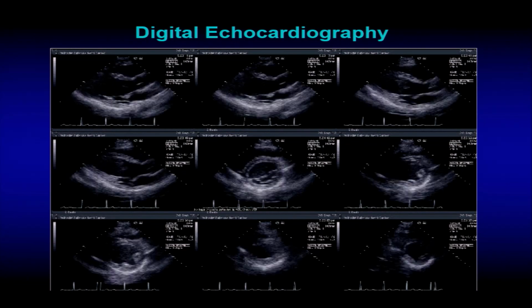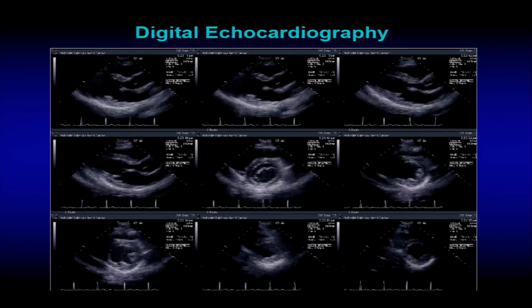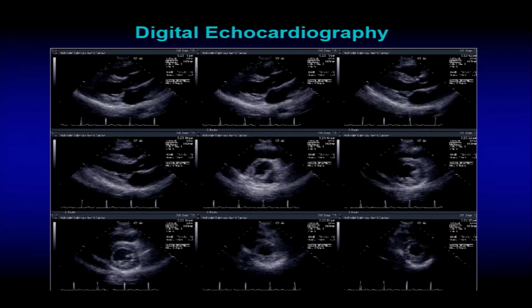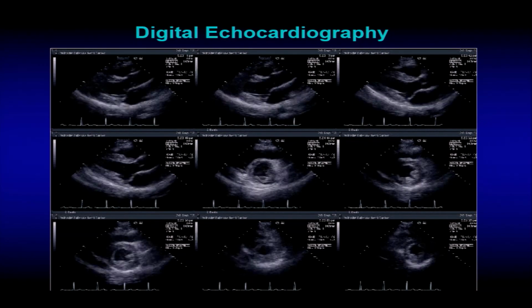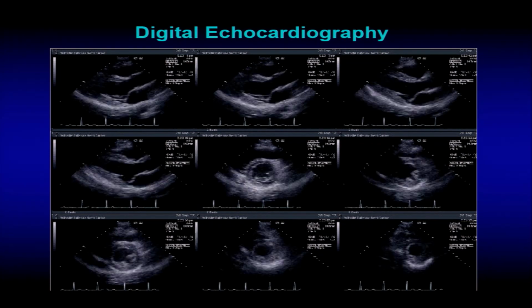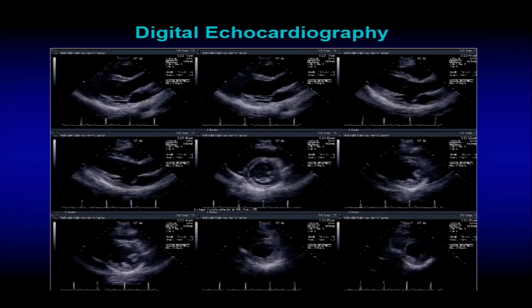But in the 2D examination, you have a series of ultrasound pictures taken by you or by the sonographer. And why is it important to display it like this in a way? It's where the measurements are, where your interpretation is. There's foreshortening, there's poor image quality at times, there is respiration, there is a PVC, there is a PAC, so many other things, right? And this is the best way for you to take a look at the whole image and decide which one you want to quantitate, which one you want to put more emphasis on in interpretation. And that's the beauty, really, of digital.